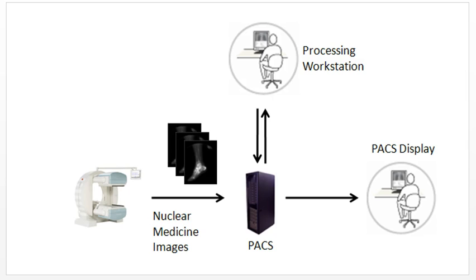Here's the diagram of the process, and notice once again that IHE prefers both the raw images and the presentation state images get sent to PACS.